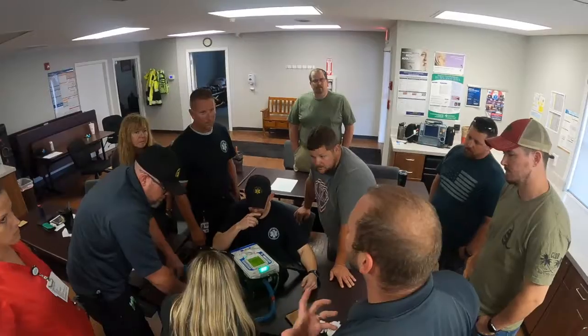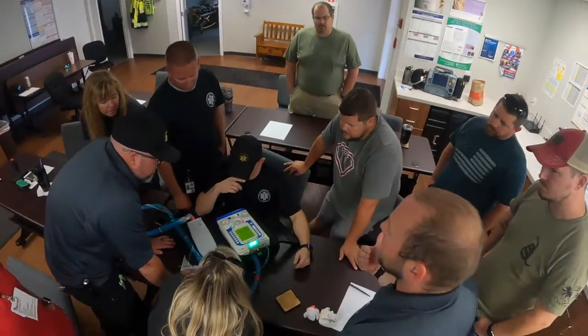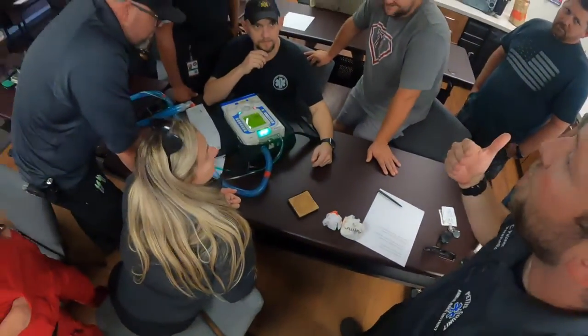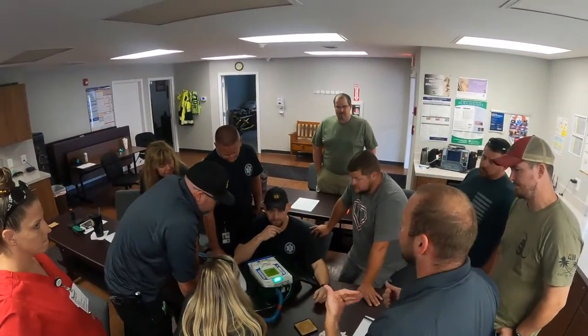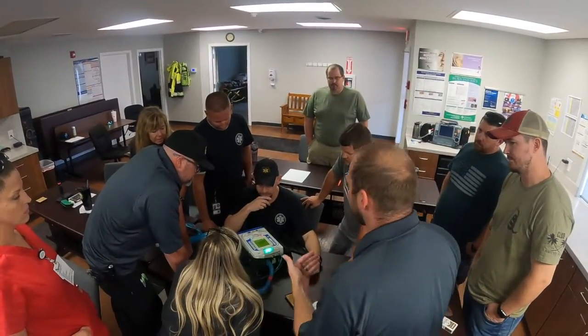This is the pressure that's holding open the alveoli. Why is that such an important aspect? Because we're going to try and figure out, do we have proper lung compliance? It can only be done with volume control, not pressure, because pressure is always constant in that mode. So no matter what, our P-plat is going to be at what we set our PIPs.